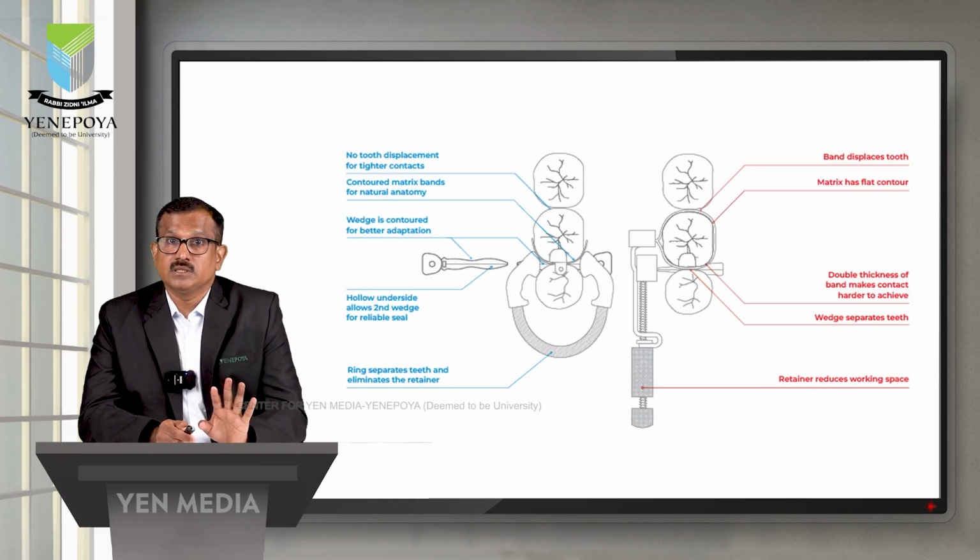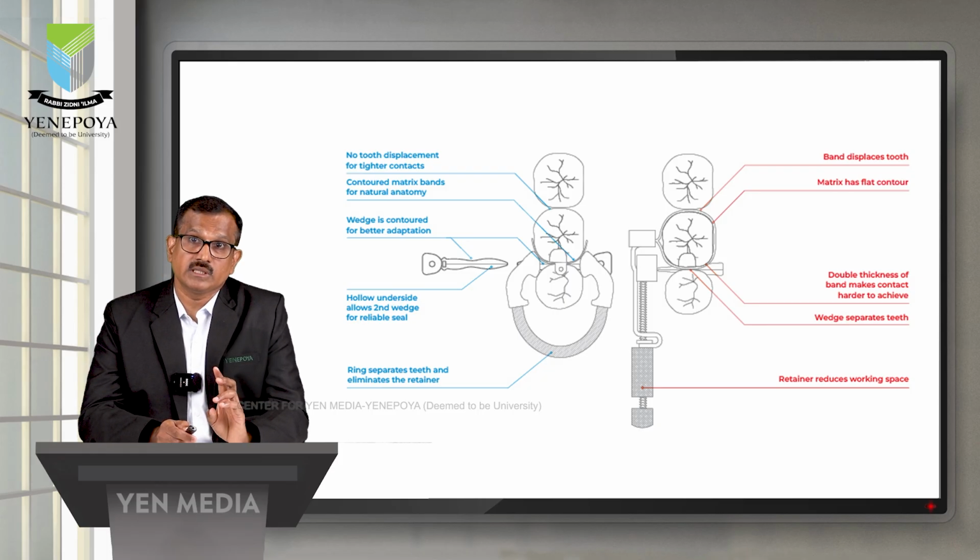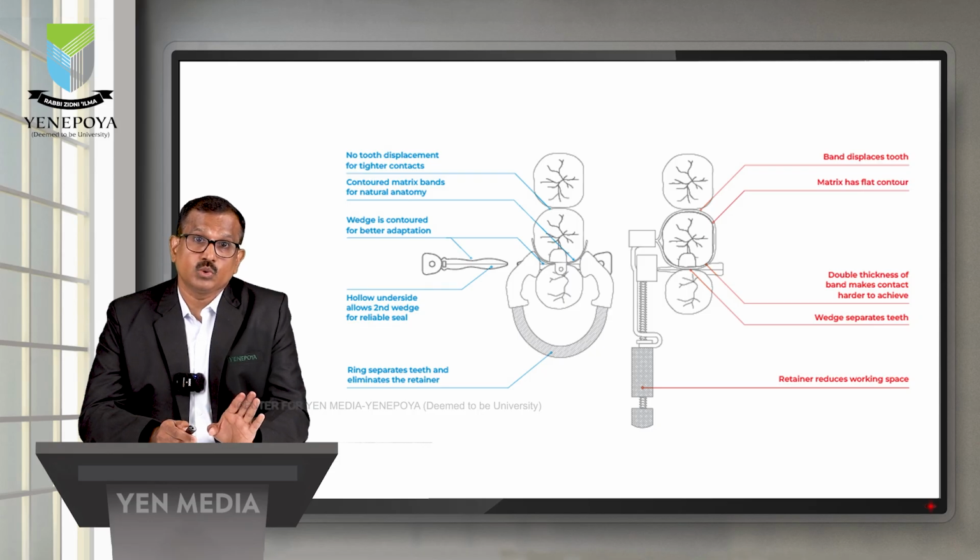So now covering all the material aspects is done, the different types of caries is over, the cavity part is over, and etching and bonding is over. Now the main part is the matricing.